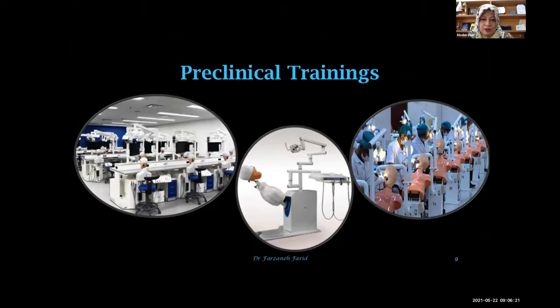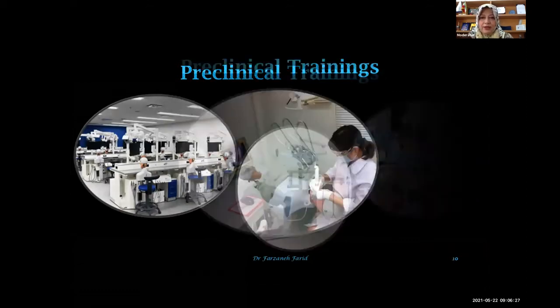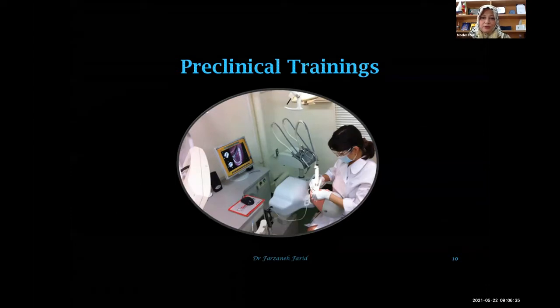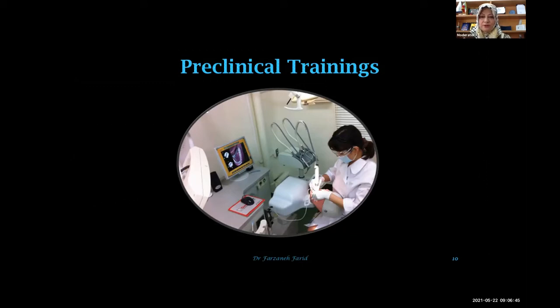And they were very useful. These simulations were very useful. Nowadays, we have dental simulator heads that are connected to monitors, and whatever the student is doing can be seen on the monitors. So she or he can see what is being done right or wrong, and can fix it in real time.